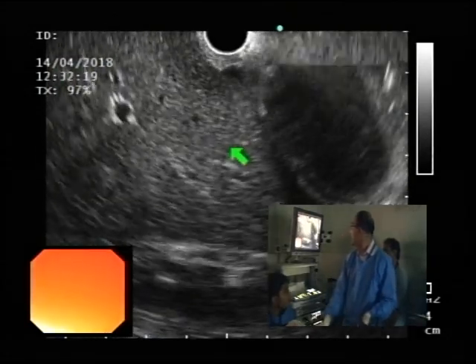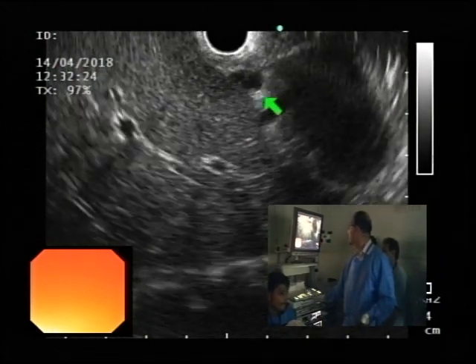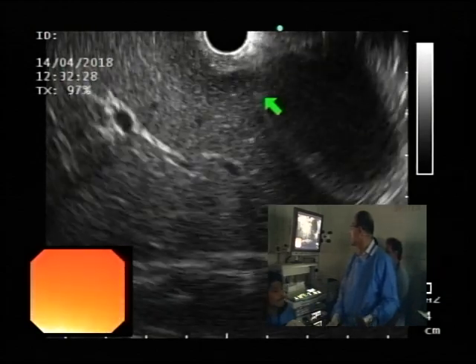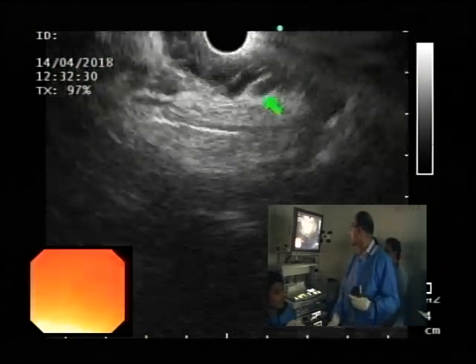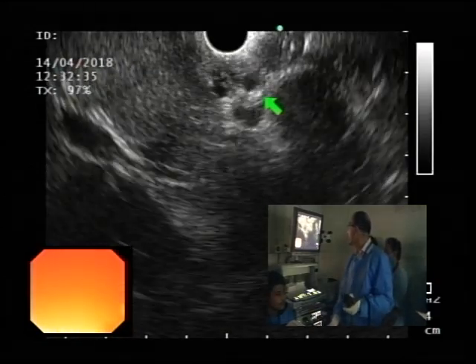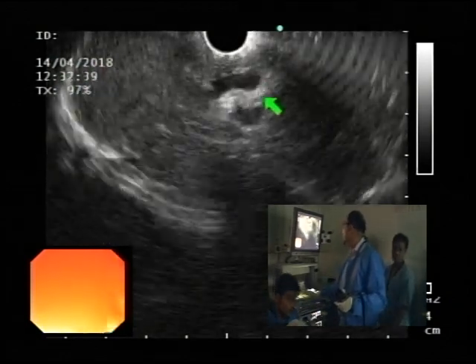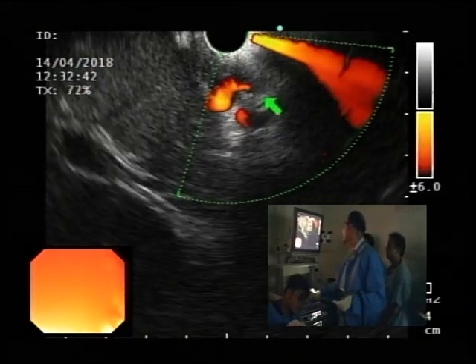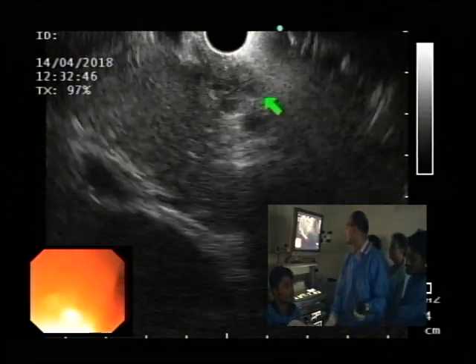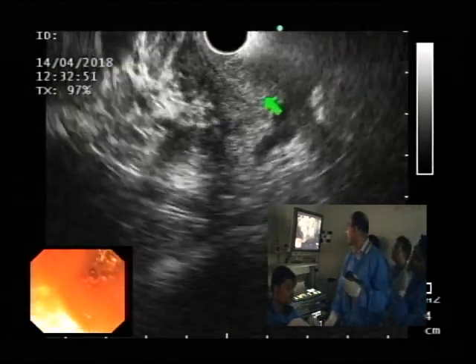So on this occasion, I think I have the bile duct at the top here. But just to confirm, I'm going to try and maintain my position and gently go clockwise. At this point, in order to differentiate vessels from the ductal structures, I'm going to use Doppler again. And these are all vessels. So I think this is probably hepatic artery rather than the bile duct itself. So I'll keep looking for a bit, and if I can find it, great. If not, then I'll move on.